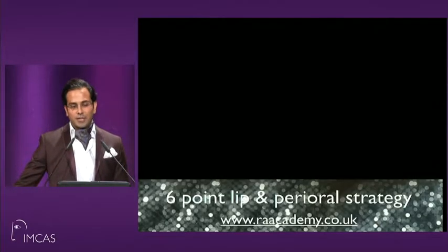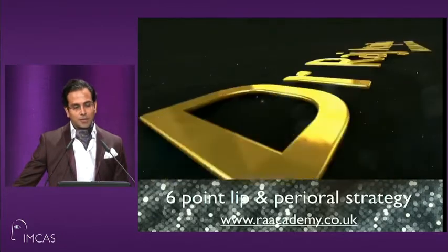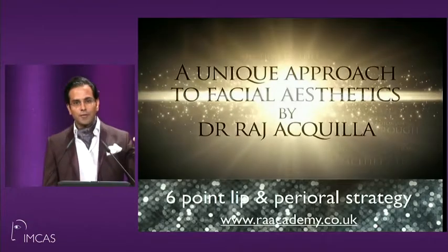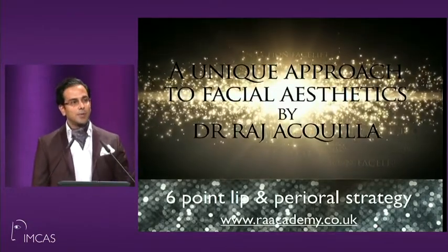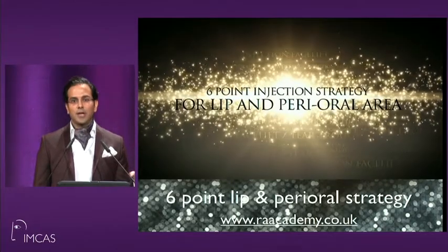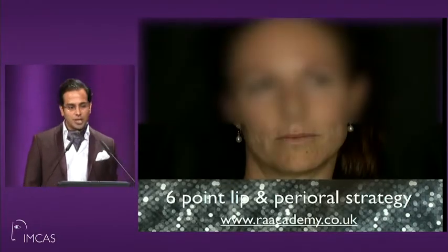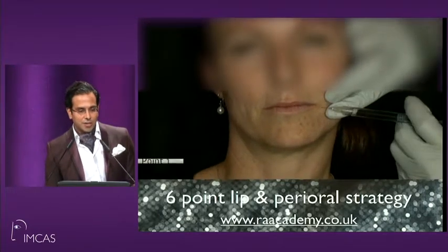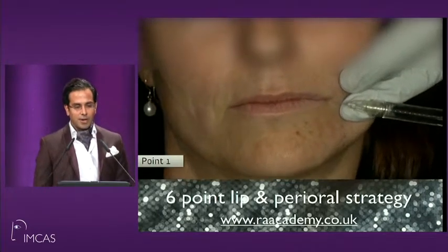Let me show you a video of a technique for the 6-point now. So really we're going to go from lateral to medial, lift the corner of the mouth, evert the lip, then deal with the Glogau-Klein point, philtral column, perioral lines, and then we'll do some volumetric change. So this is a lady I injected in Australia last year. She was very compliant, as you can see here.